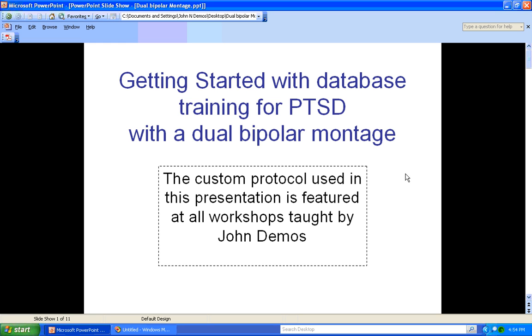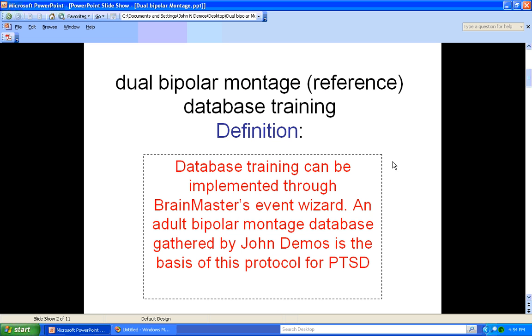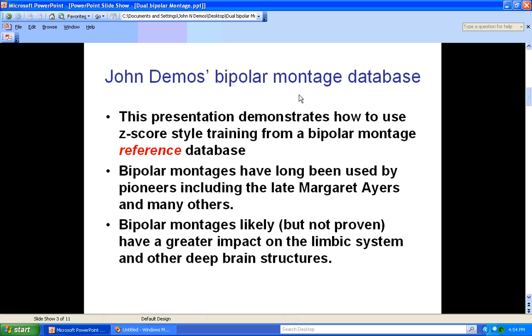Welcome to getting started with database training for post-traumatic stress disorder using a bipolar montage. The custom protocol used in this presentation is featured at all workshops taught by John Deimos. Database training can be implemented in a number of ways, including Brain Master's Event Wizard. This presentation demonstrates how to use a z-score style training from a bipolar montage reference database.